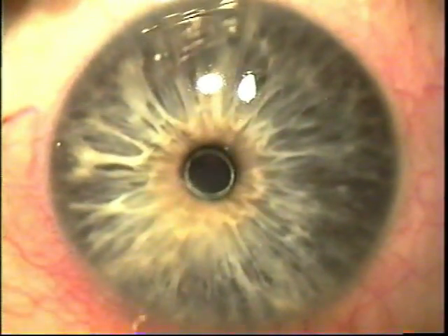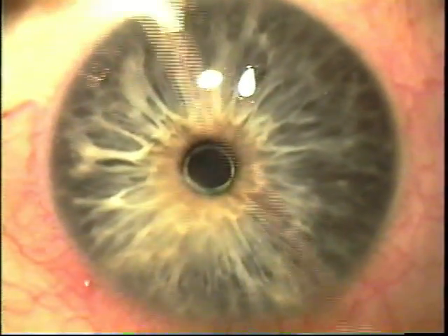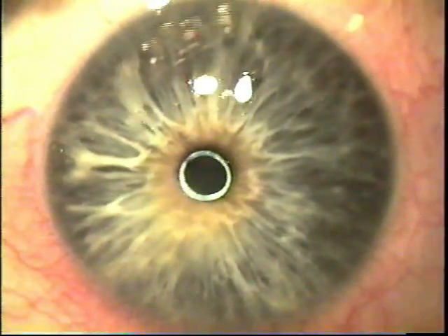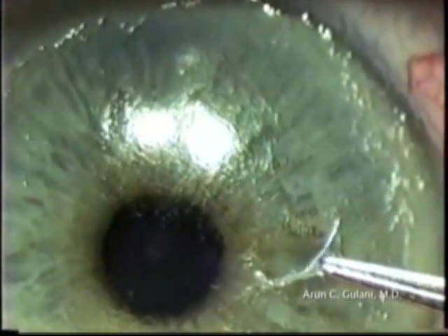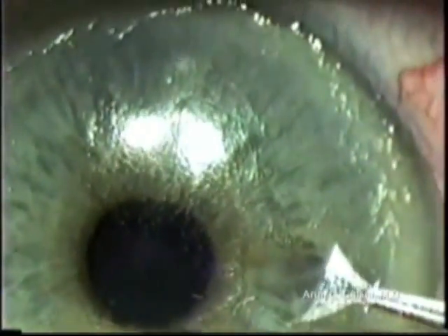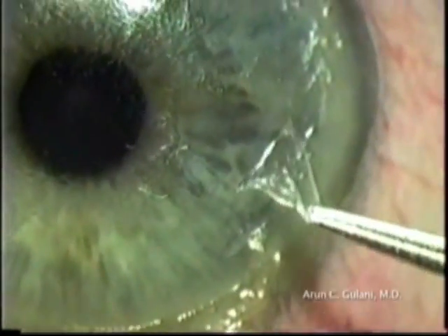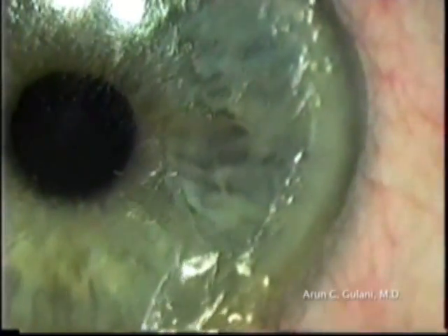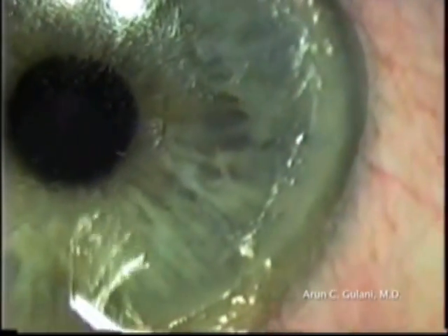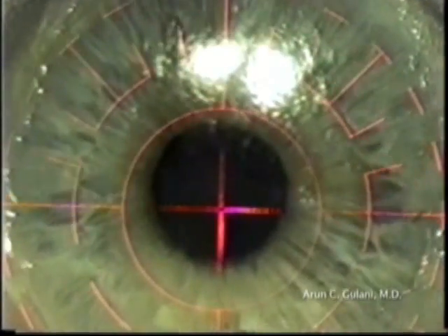Notice that on application of BSS solution, the light reflex which was D-shaped has now become circular — this translates to vision. In on-corneal scars like these, they can be peeled off right under the laser in what I call a resistance-guided technique, where you pull on the scar but make sure you remove it completely in one piece, using the rest of the cornea as your resistance platform. This is then followed by laser PRK to emmetropia.